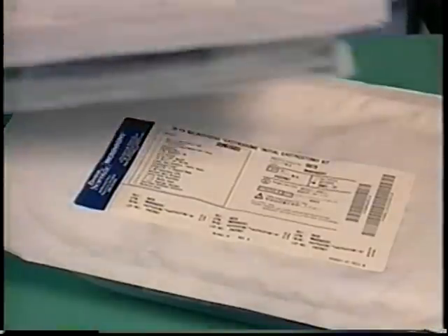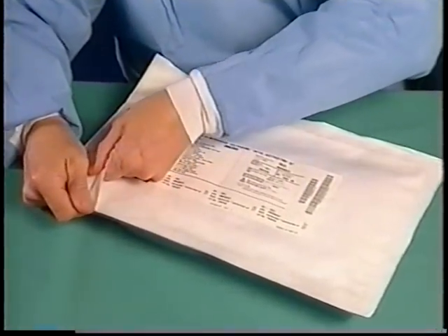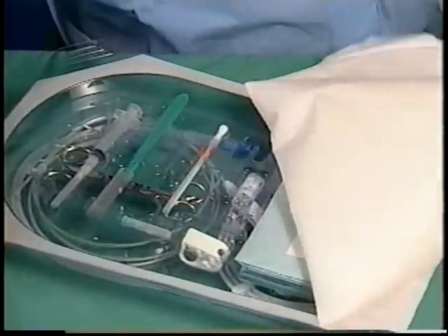The initial placement PEGs are supplied in sterile kits that contain the necessary accessories for placement. These kits may be supplied as a single bag, single tray, or two-tier tray system. Two-tier tray systems are preferred since they organize the equipment in a way that increases the efficiency of the procedure.